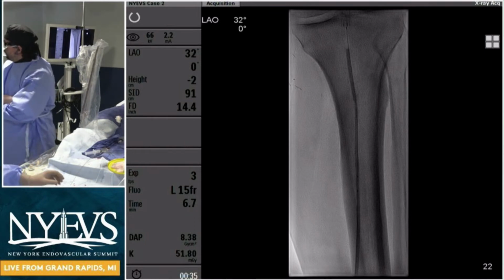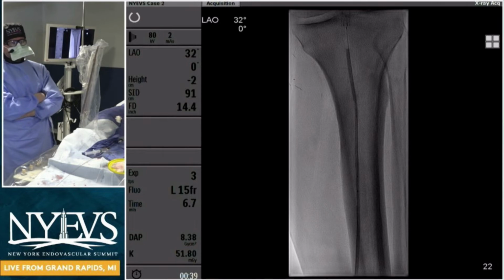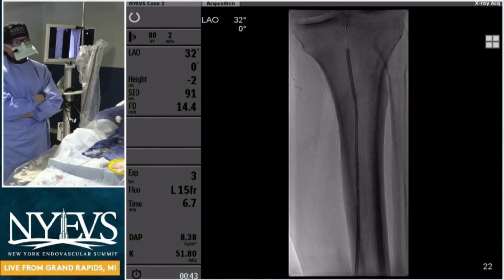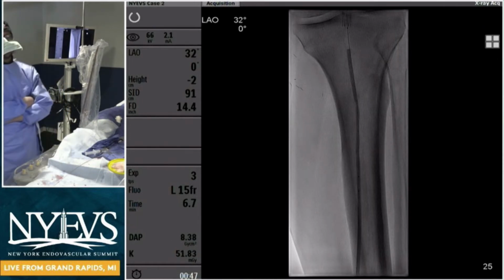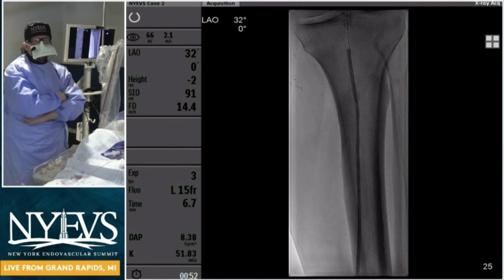Can you pull out the IVUS images, please? So Fadi, I guess the question here, and I think it's a valid question, is sizing of the laser. I mean, you went with a 1.7, right? And obviously the vessel, at least the stent, looks like at least a 5 millimeter stent. So can you guys put the IVUS image up?